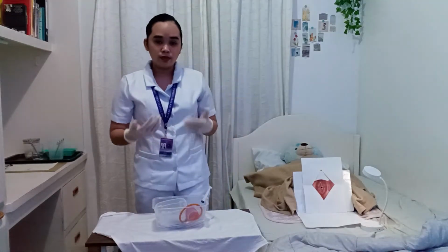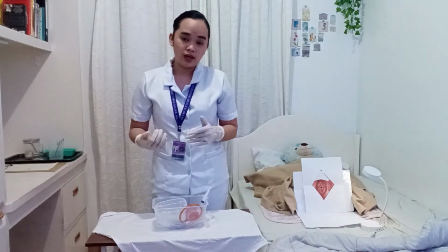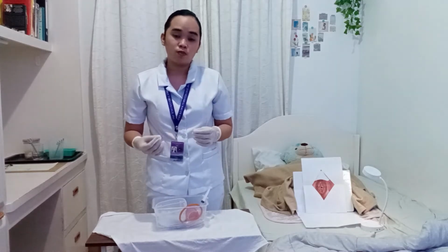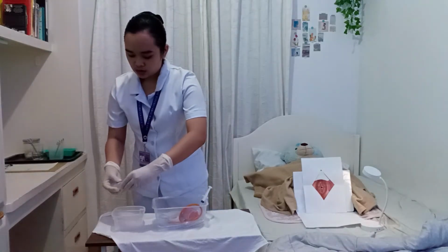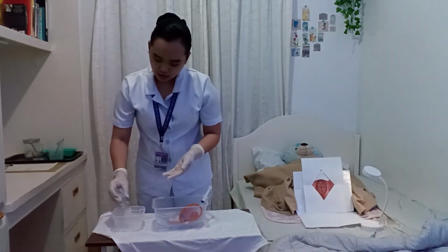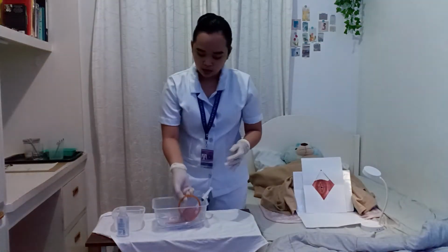So now we're going to lubricate the catheter for about 1.5 inches, being careful not to plug the eye of the catheter. So lubricating the catheter will reduce friction and will prevent urethral trauma, which reduces the pain upon insertion. Okay. So this is the lubricant. And then we're going to get the catheter.